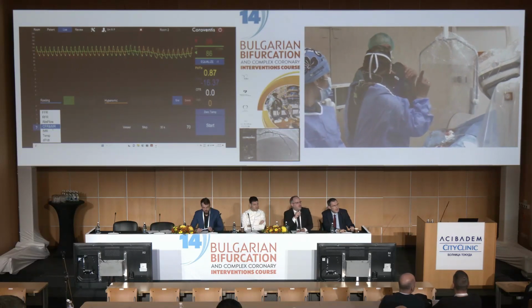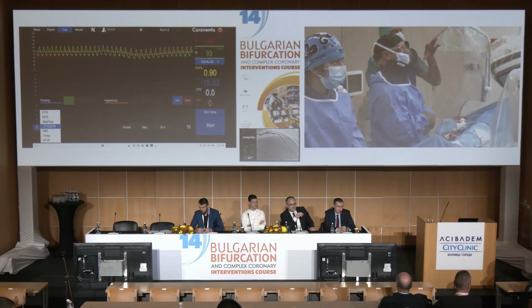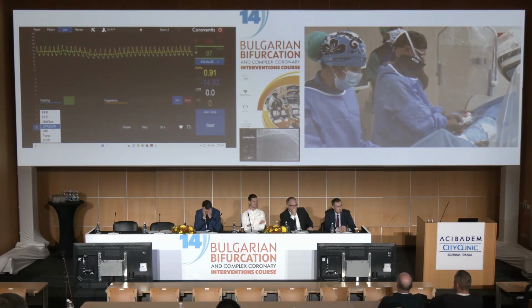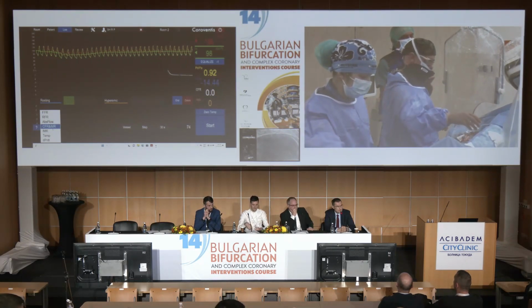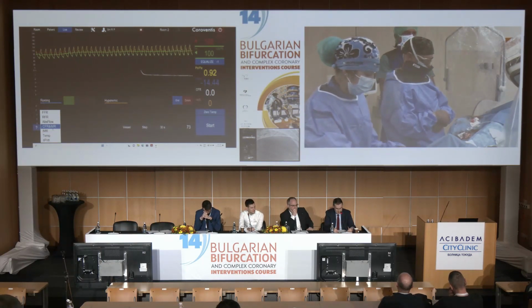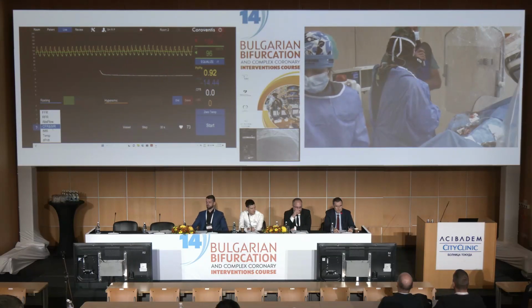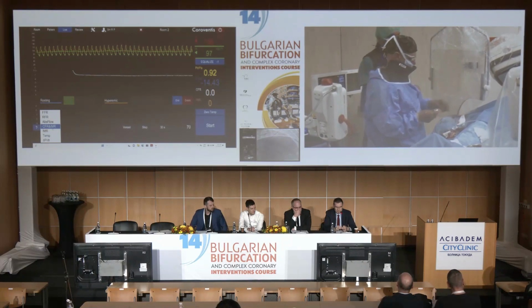Yes, the Doppler wire. Yes, the flow wire does not exist anymore. That's why I'm asking. I know that it doesn't exist, and the question is because it was updated like the flow. We were doing CFR back in 2000, 20 years ago. Is it still valid? No, the Doppler flow wire is not commercially available, and I heard rumors from Philips saying that probably this year it will be available again. So that's something we have to keep in mind. It's a fantastic tool, but if not available, it's not really fantastic.